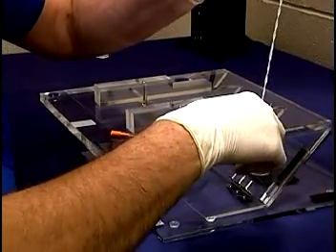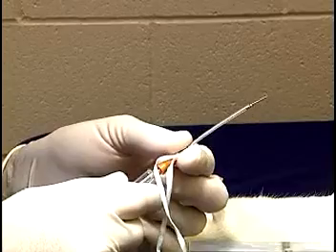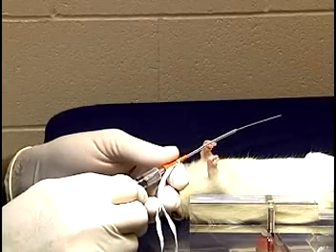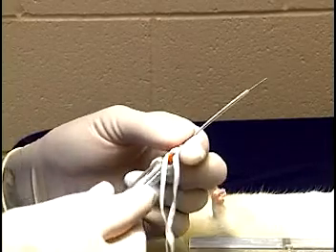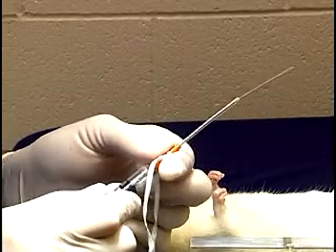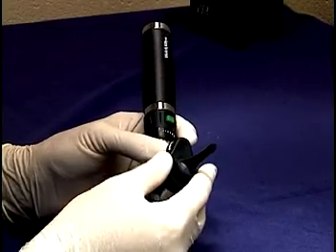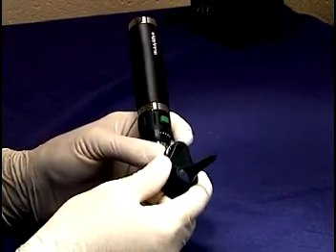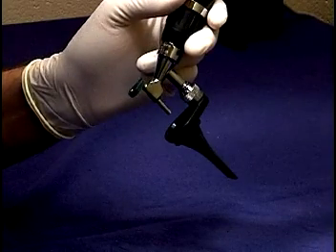A hole is provided in the work stand to hold the taped container. The tube is then placed over the guide wire, making sure that it is loosely fitted to the syringe hub so that it can be easily advanced once the guide wire is in place. The guide wire is adjusted using the syringe plunger. It must be long enough to reach at least the midpoint of the trachea, but should not reach the bifurcation. The speculum is now placed on the otoscope with the cutaway portion facing the operator's dominant hand. Remember that the handle of the otoscope will be up, not down, when it is used.